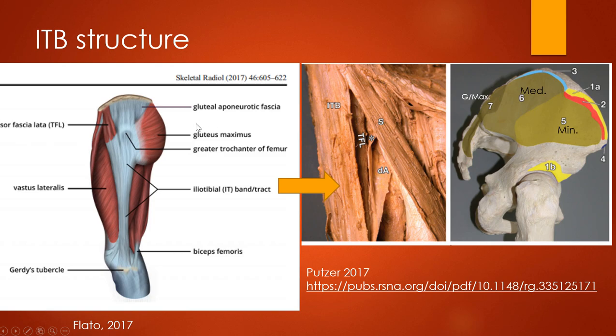Next we're going to look at a dynamic ultrasound case where we could successfully see a translation of the iliotibial tract over the gluteus maximus. The patient had an audible snap and with pain, and in this case the patient had to stand for us to reproduce the snap. We could have tried flexion with an adducted hip moving to an extended hip, but this didn't quite work for this particular patient.